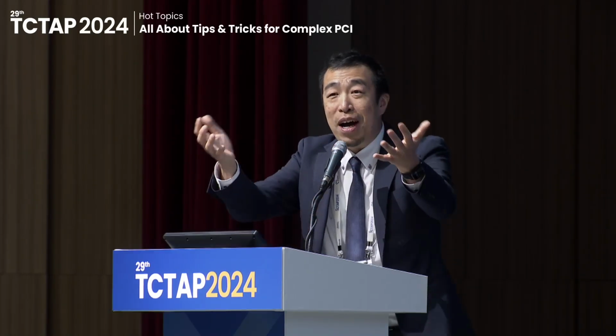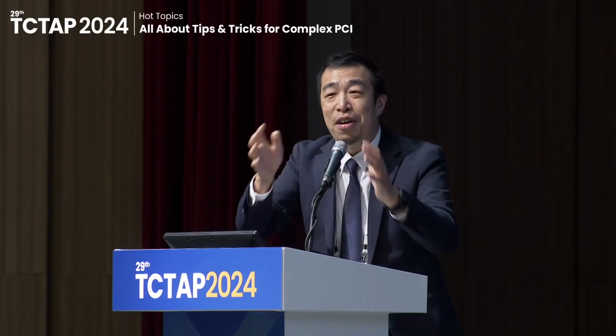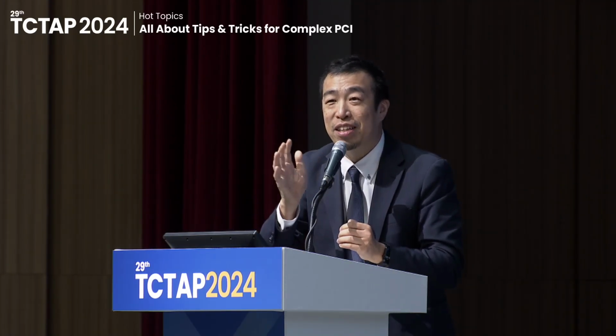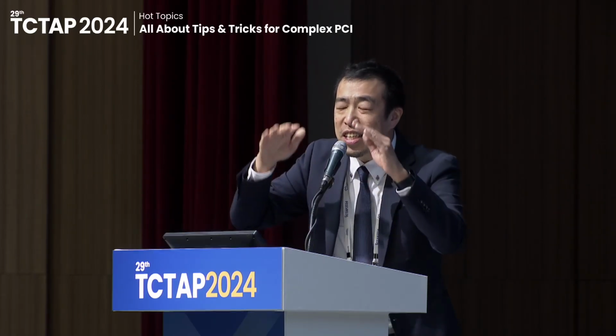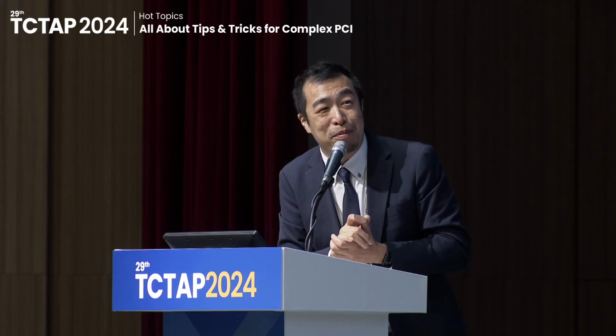Some doctors ask me how much volume we should perfuse. For the perfusion device of Kaneka, the official data is 20 to 30 milliliter per minute. So we can inject 20 to 30 milliliter if chest pain is present, and if chest pain decreases, a relatively lower volume is okay, I think.